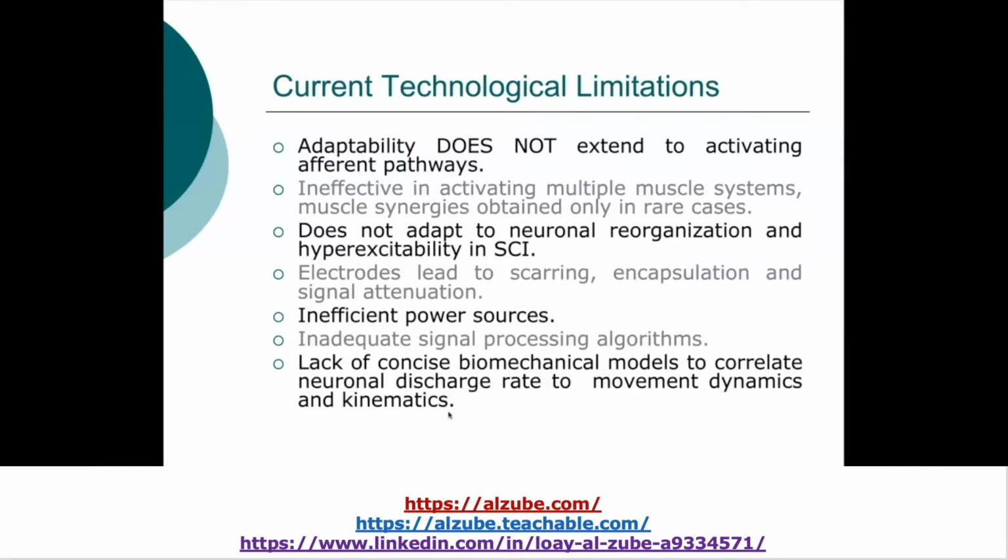And then we have inefficient power sources. You need batteries, and you need to charge them. If you're having a device that needs power in the body for a long period of time, that's going to be a challenge. And then we have inadequate signal processing algorithms.